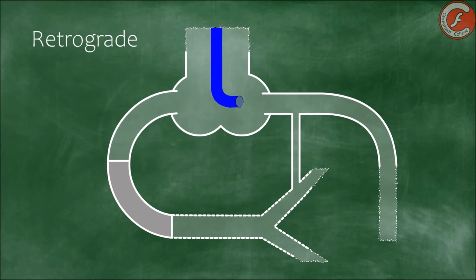Independently of the retrograde technique used, all of them have a first common step, accessing the distal bed of the occluded vessel through the collateral branches that offer the donor blood vessel.